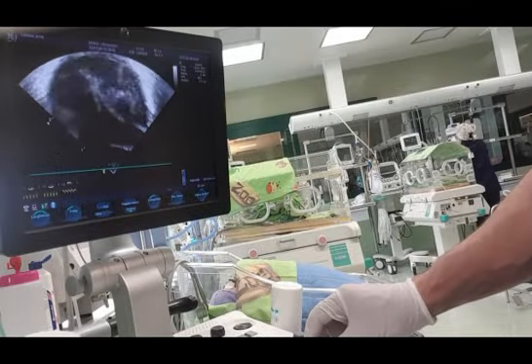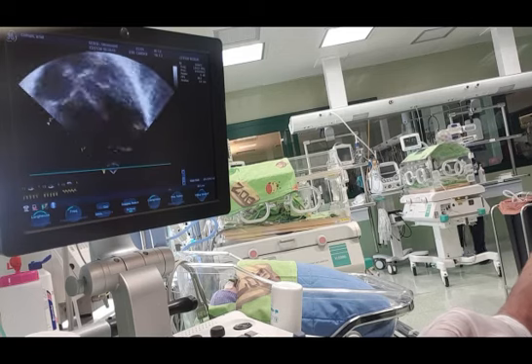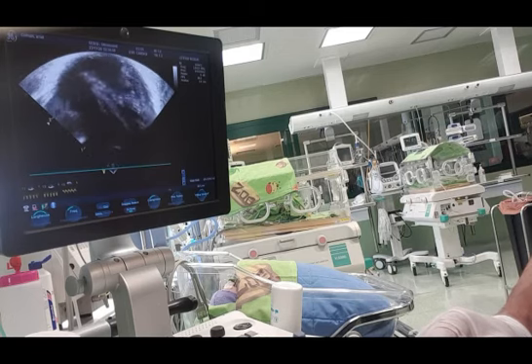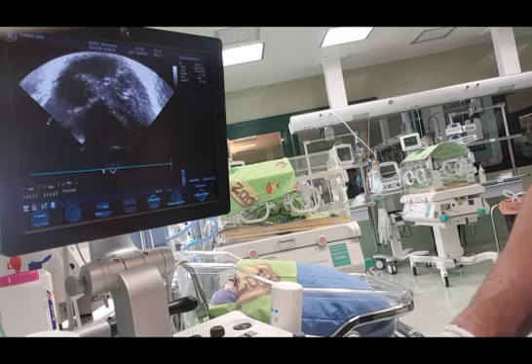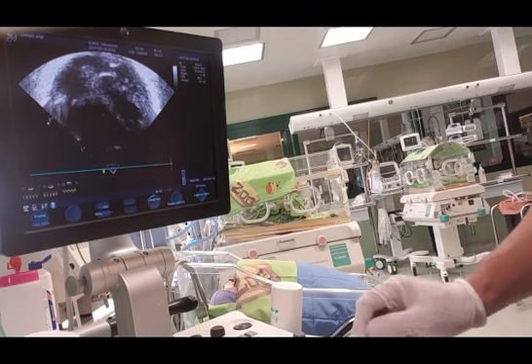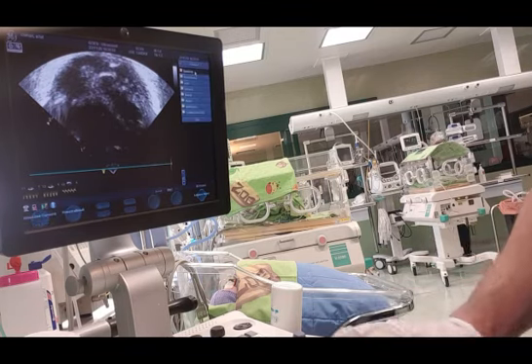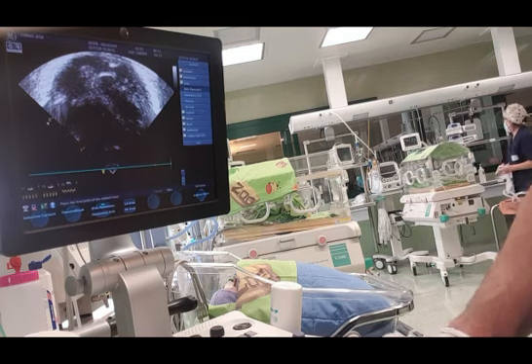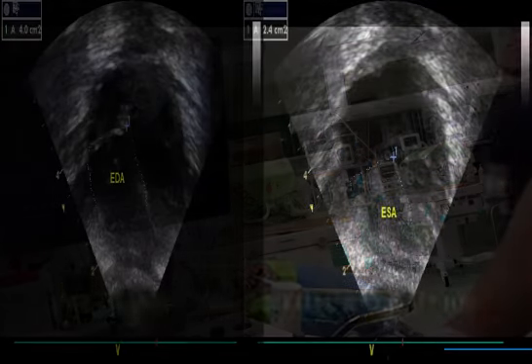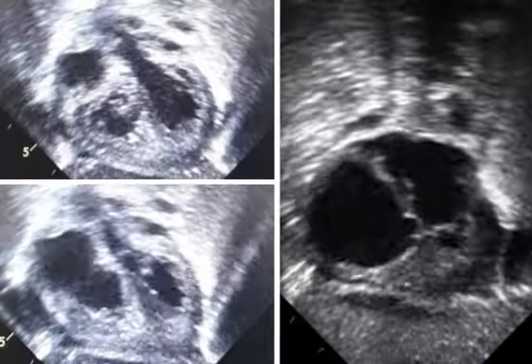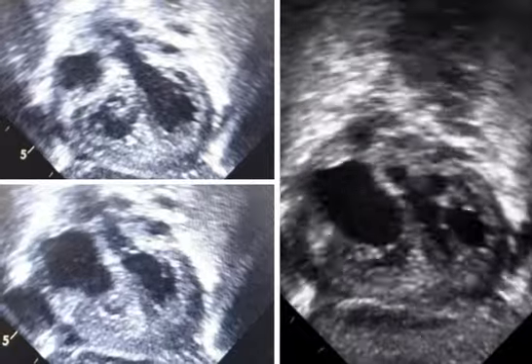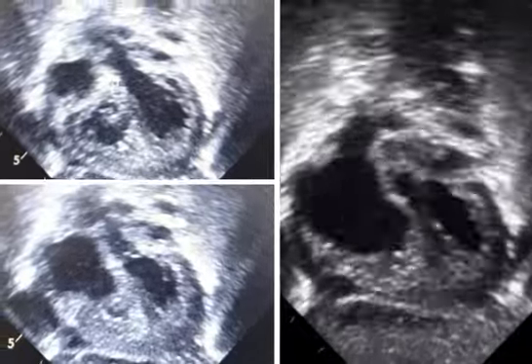Right ventricle fractional area change is a planometric measure of the ratio of systolic to diastolic area in the apical 4 or 3 chamber view, by manual tracing of the endocardial border of the right ventricle. Fractional area change is calculated by the following formula. It is important that the entire ventricle is visualized when tracing the endocardium in systole and diastole, including the outflow tract and the lateral wall.